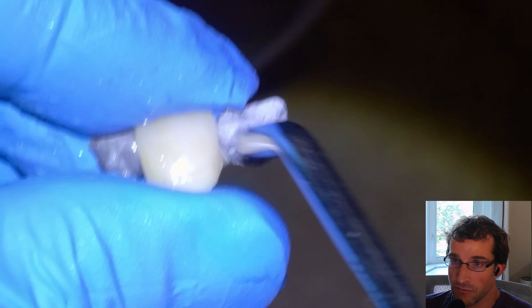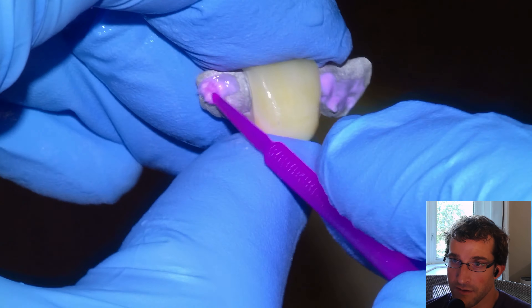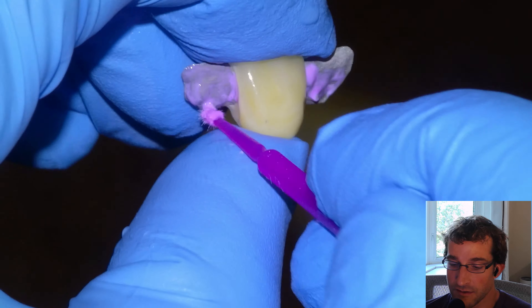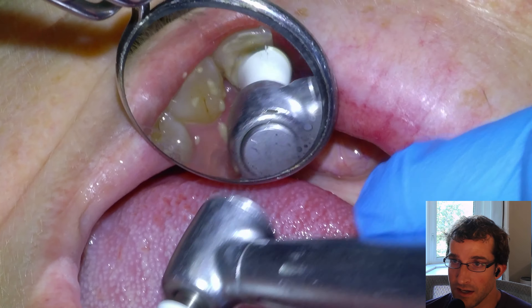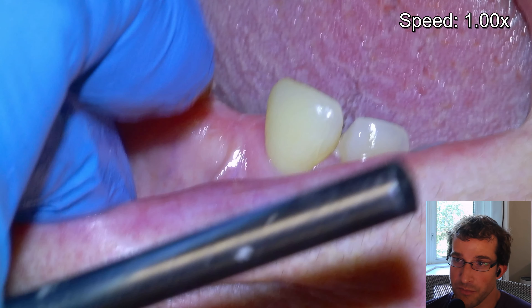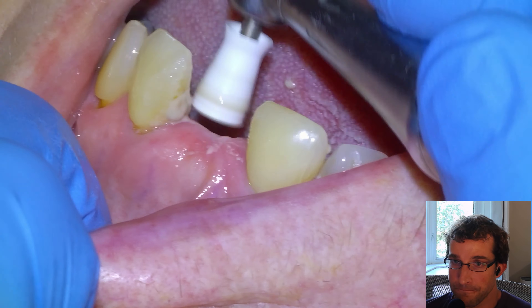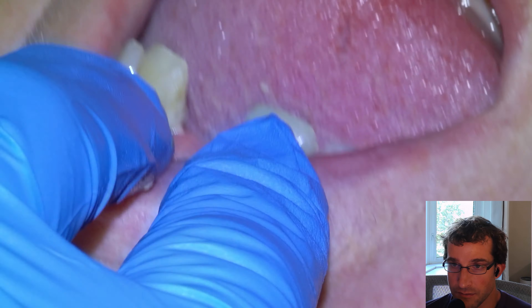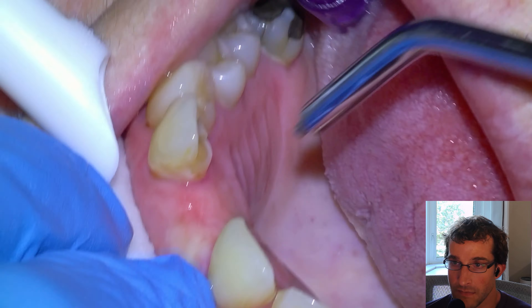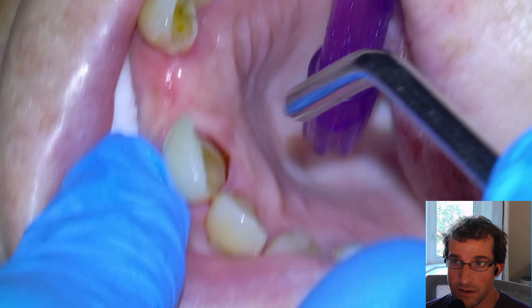Once we try it in and we're happy, one last time we'll rinse and dry, then use Ivoclean to clean the surface of the wings, rinse that off, and dry it — that's going to be ready to go. Then we'll pumice the teeth. We didn't use a rubber dam; we had about a millimeter or two of clearance from the gums to the tooth. The gums did bleed a little bit. We'll use a cotton roll to push the cheek back, then rinse and dry.